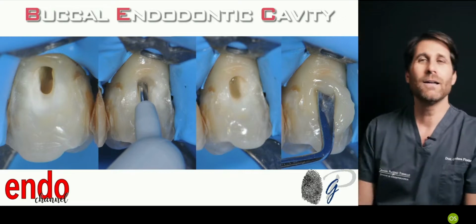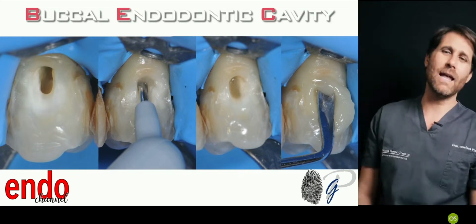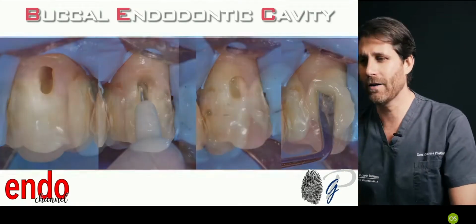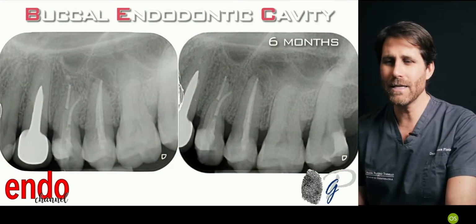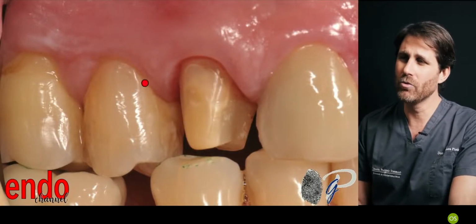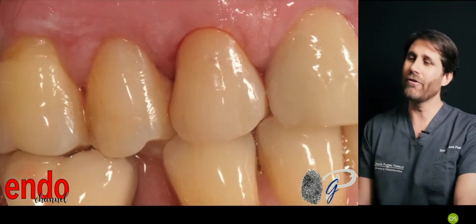Like we do with gutta-percha and cement, this flowable composite acts as a cement that is pushed into all the undercuts to try to reduce the accumulation and inclusion of voids. And this is then the final restoration of the so-called buccal premolar, and then the retreatment and the final crown restoration on the first premolar.